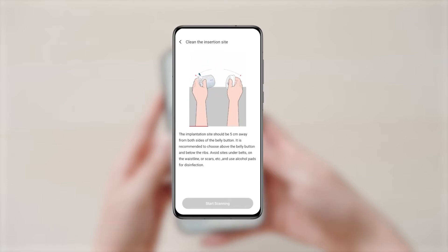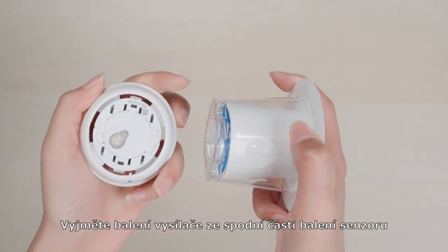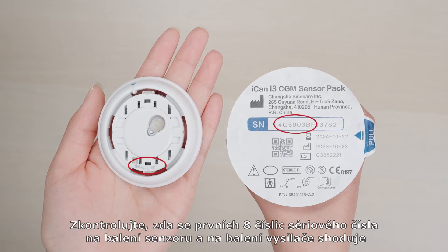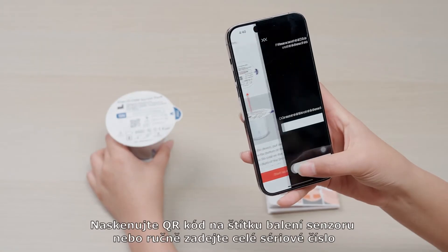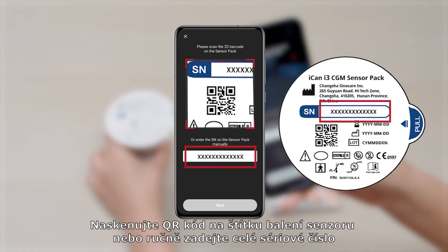To start your 15 days with ICANN, pull out the transmitter pack from the bottom of the sensor pack. Check that the first eight digits of the SN codes on the sensor pack and the transmitter pack are the same. Scan the QR code located on the sensor pack label, or enter the full SN code on the sensor pack by typing manually.